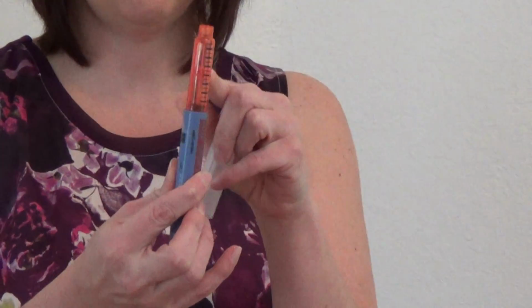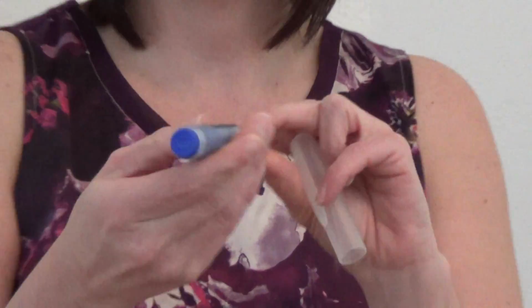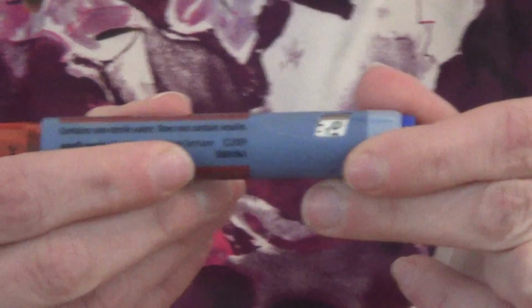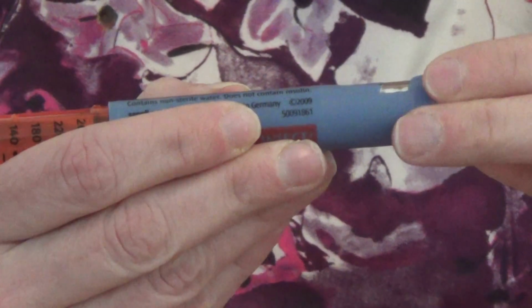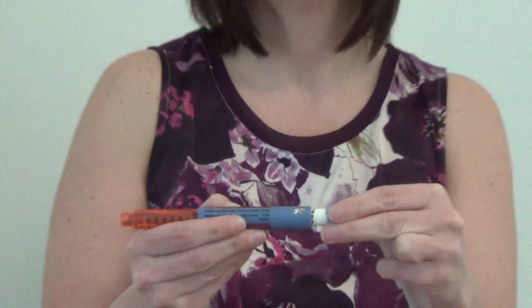The pen consists of a pen cap, a reservoir which holds your insulin, a place to screw on your needle, and your dose counter. Your dose counter can be moved up or down, but it can't be moved beyond 80 units. If you inject more than 80 units a day, you have to do 2 injections and make sure you change off the needle. You can't use more units than are left in the pen. So if you only have 10 units left in the pen, that's the most units you would be able to inject from the pen.